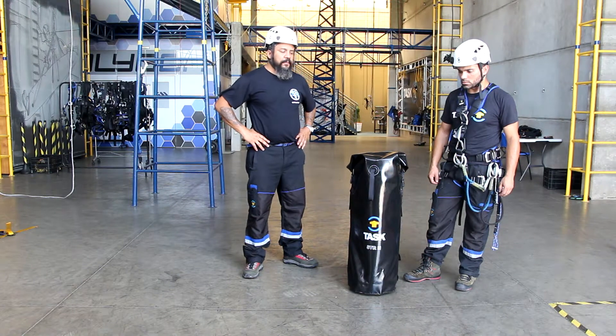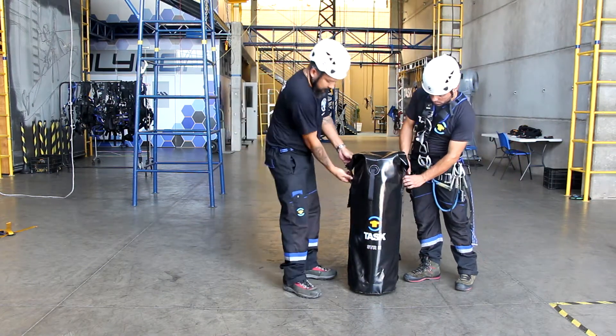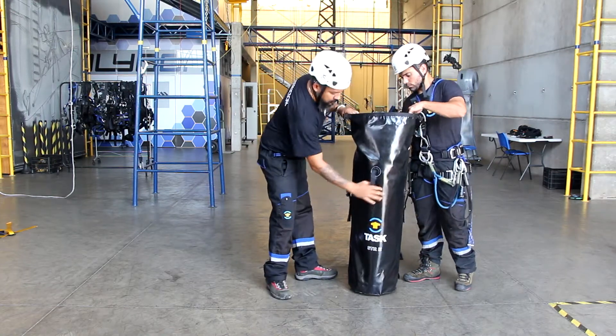This is the best procedure to prepare and to keep the STR2 stretcher by Task. This procedure is better performed by two attendants.